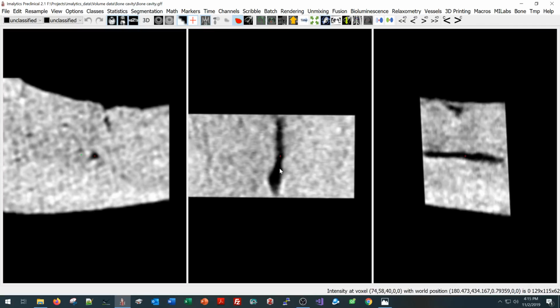You can rotate it, and you can see that they have a kind of matchstick shape here. And in this analysis we are going to skeletonize this cavity and compute the cross-sectional area orthogonal to the path here, and also the largest fitting sphere inside as a statistic readout. So let's start by segmenting the cavity, and we can do this using thresholding and region growing.